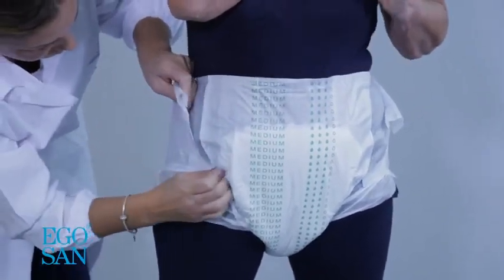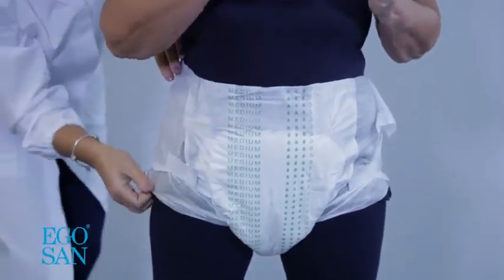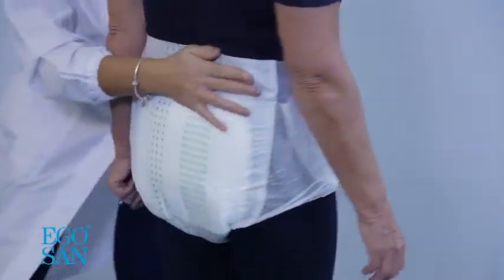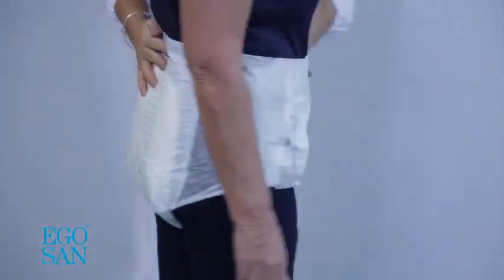When the pad is soaked, the marking fades away. Put the device into place at the back, positioning the outer edges over the abdomen, thus covering the hips. Check that it fits snugly into the groin area without being too tight.